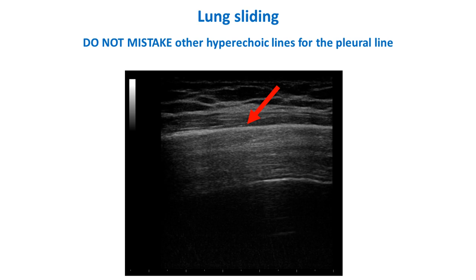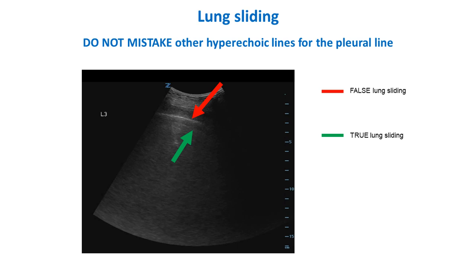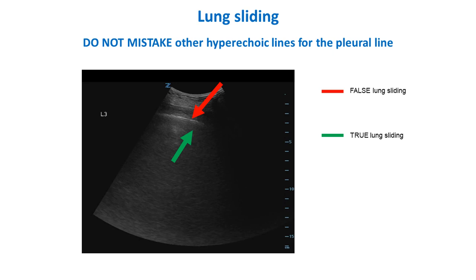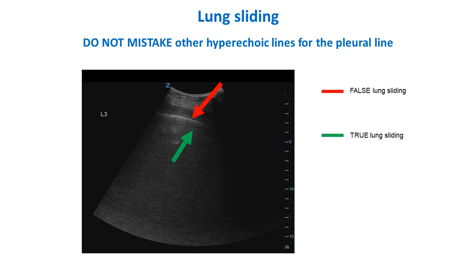Here is another example where the red arrow indicates a hyperechoic horizontal line which is not the pleural line — it may be a muscular fascia. The real pleural line is underneath, not clearly visible, indicated by the green arrow. What we have to consider is not just a general movement but the sliding of the pleural line compared to the structures above.